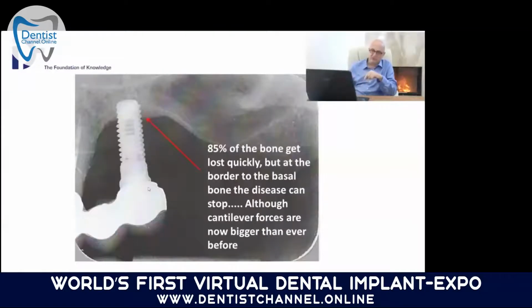I mentioned already several times the word corticobasal. So corticobasal consists of cortico, from cortical, or this hard bone, round bone, and basal. So corticobasal implants actually utilize this type of bone, which is left here only. And that's why they are so successful. All the rest of the bone, which is already lost here, is not used anyway. This implant never needed this bone, which is now lost.